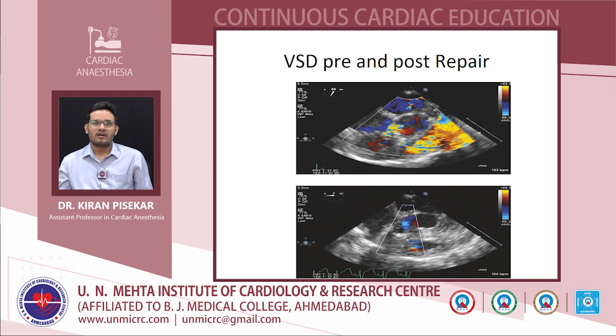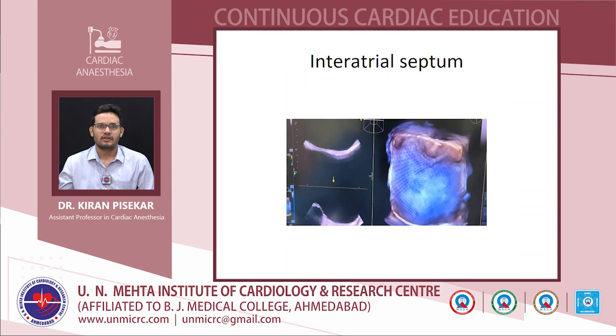So again, to confirm the diagnosis, we have to assess it in different planes. This is an image showing the pre and post-op repair. Pre-operatively we can see the VSD flow, and in post-op there is no flow, and we can see the patch. So there is no flow across the patch post-operatively.